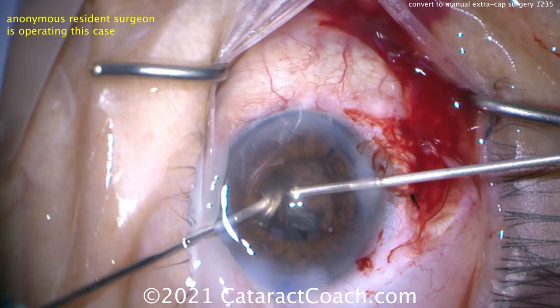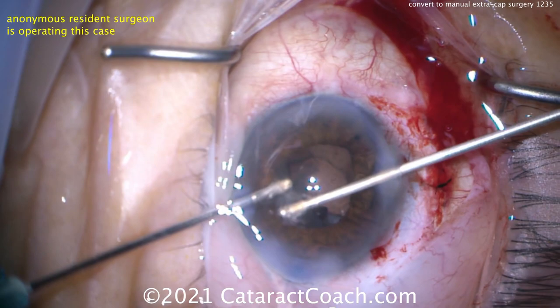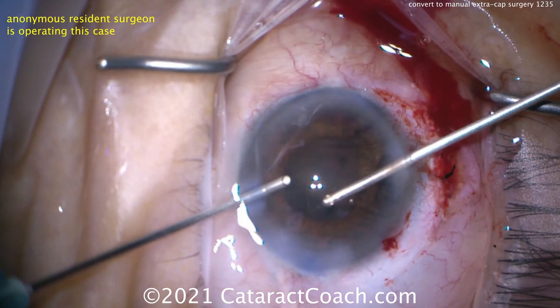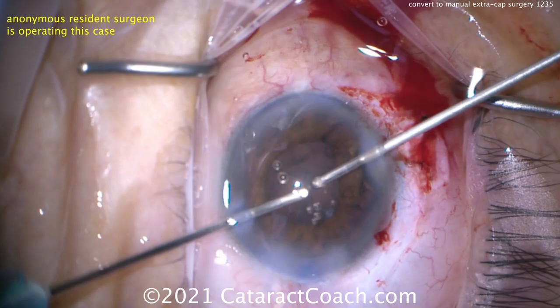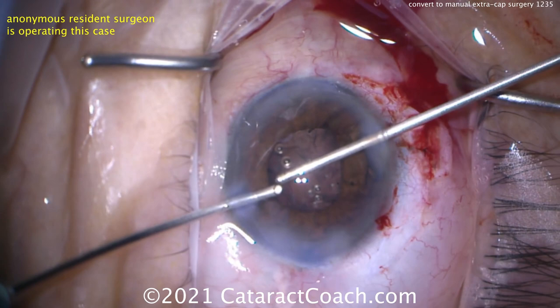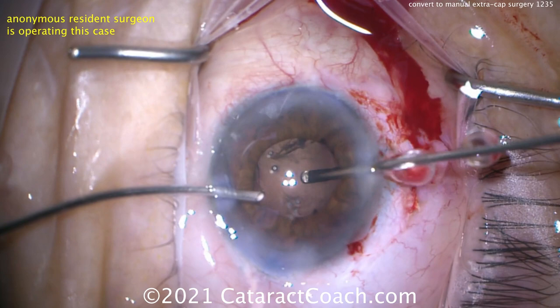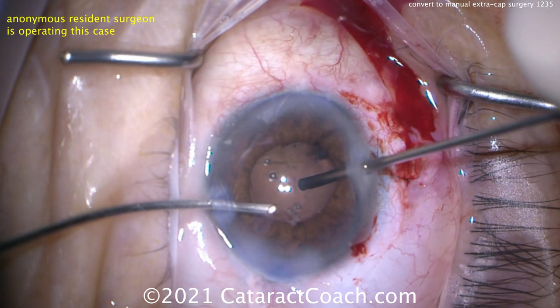Remember, by having a ruptured posterior capsule you've increased the risk of endophthalmitis by many fold, increased the risk of retinal detachment, and increased the risk of macular edema. Be very careful. Cleaning up remaining material with the bimanual vitrector. Use your judgment — if you don't have prolapsed vitreous, you can use IA cut mode. If you're afraid of inadvertently engaging the cutter and damaging the capsule, you can switch to cortex mode on the machine, increasing infusion and decreasing aspiration flow rate.